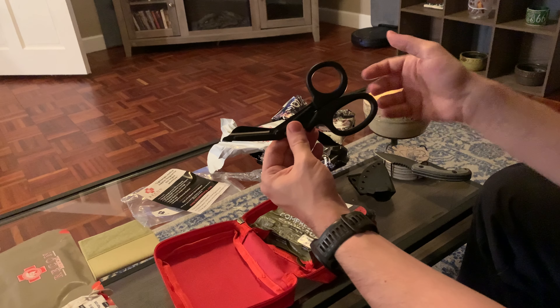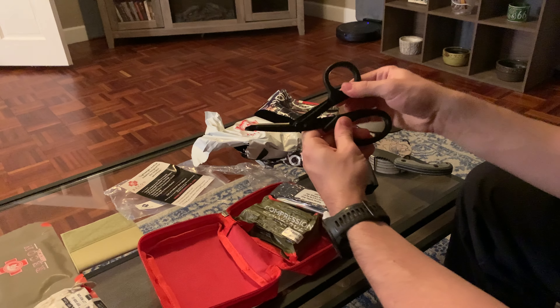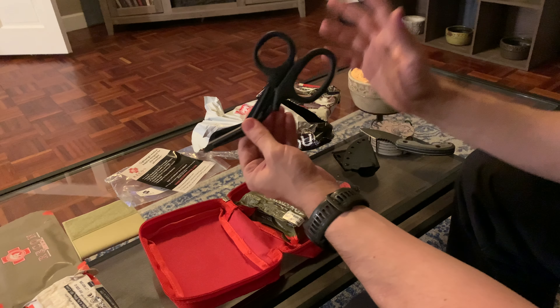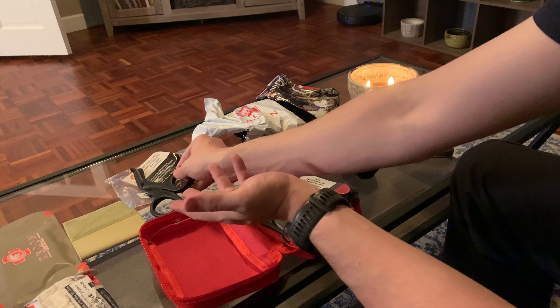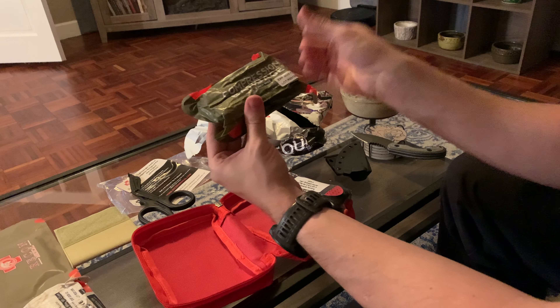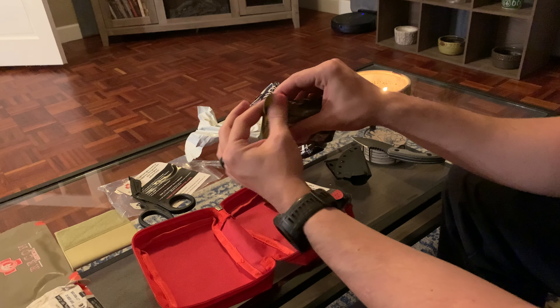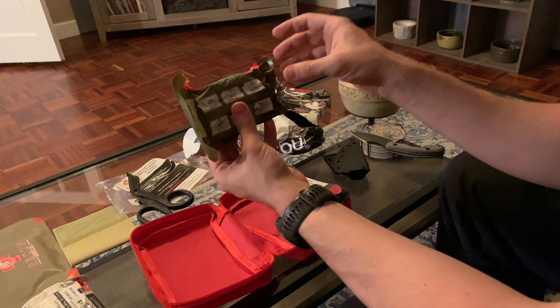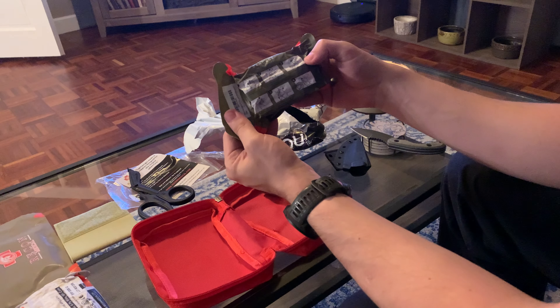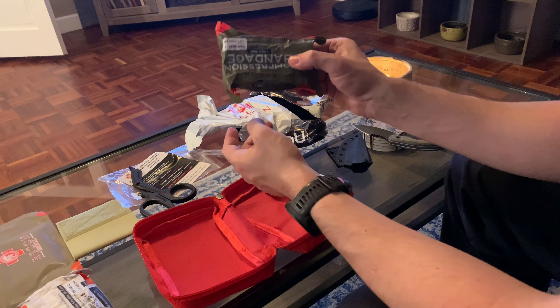Let's go to the shears. These are four-inch trauma shears — got their name, Recon Medical, on them. Really nice black. I feel like that's going to cut through a lot — let's put it to the test. Yep, they work. A lot of people do videos wanting ones that cut through pennies and stuff like that. As long as this can cut through denim, clothes, and seatbelts if need be, that's all I care about. I don't need this to cut through a penny. This will do just fine for a $25 kit — you really can't complain.